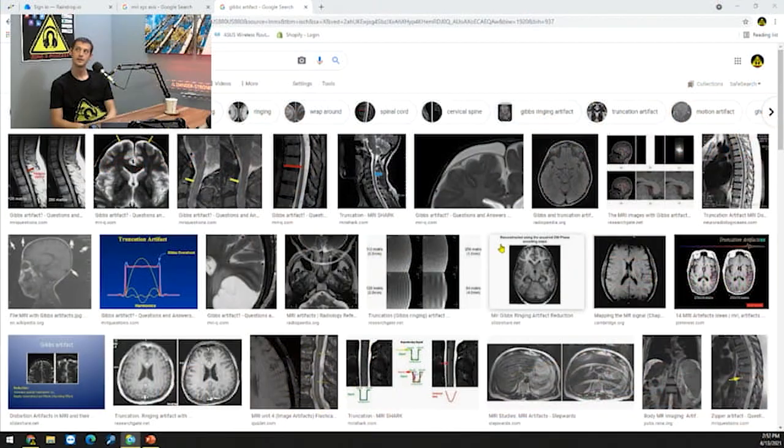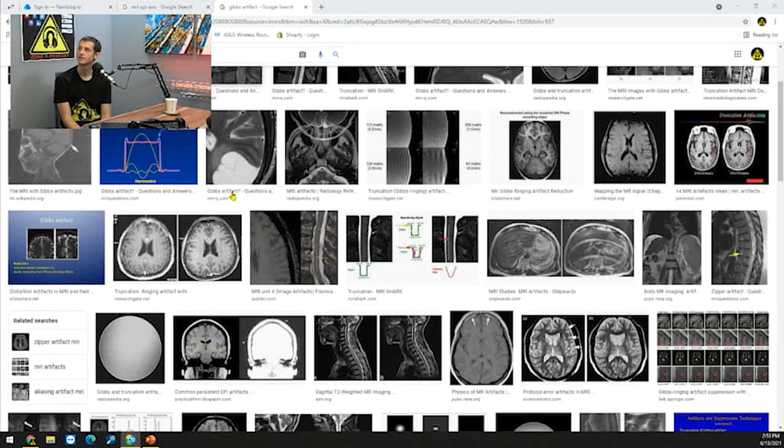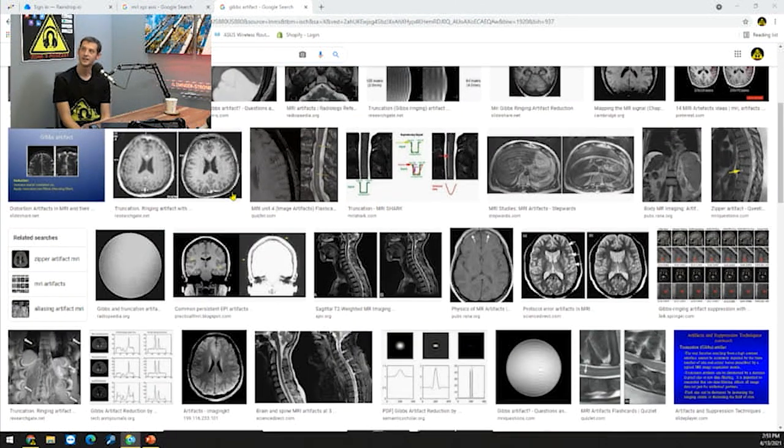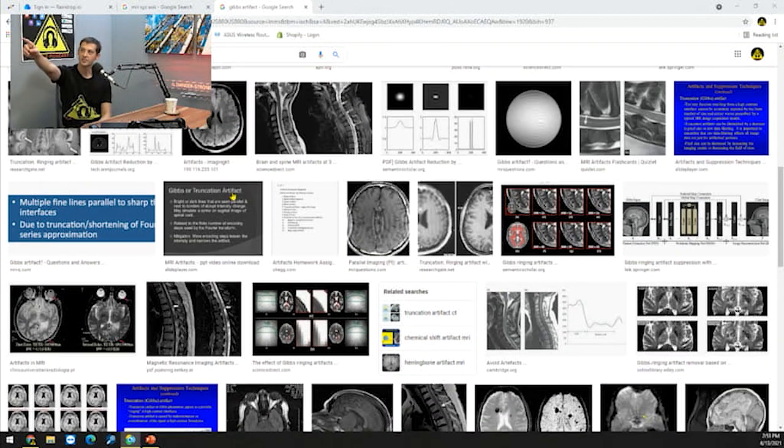Yeah. And those wobbles, if you had more Kspace acquisitions, it would get rid of some of those wobbles. Do you see a good example there? Let's look. There's a wrap. Go to the center. Truncation, I guess. Yeah, that one. Click that one for just a sec.